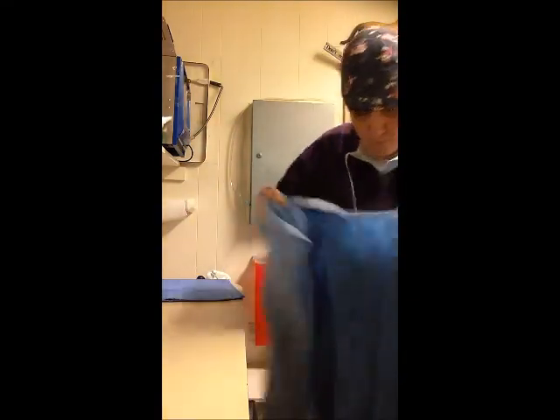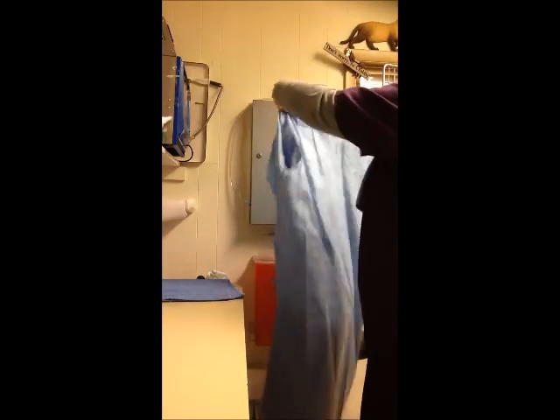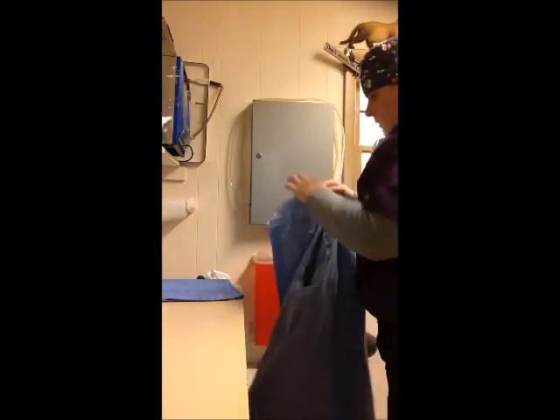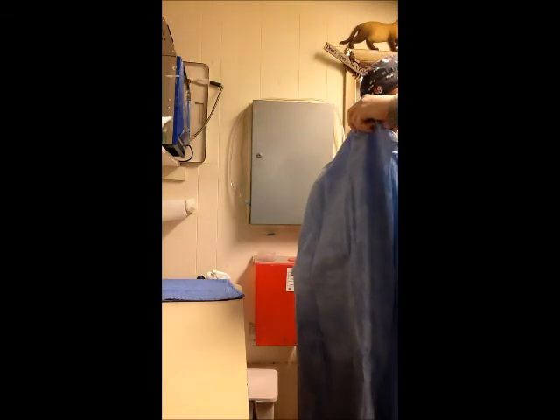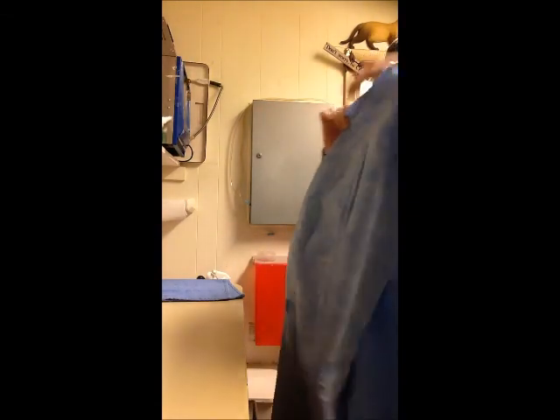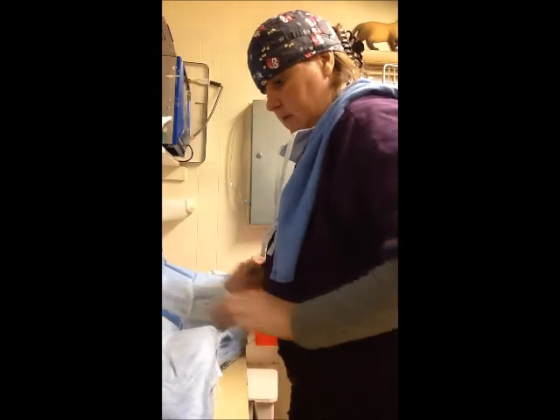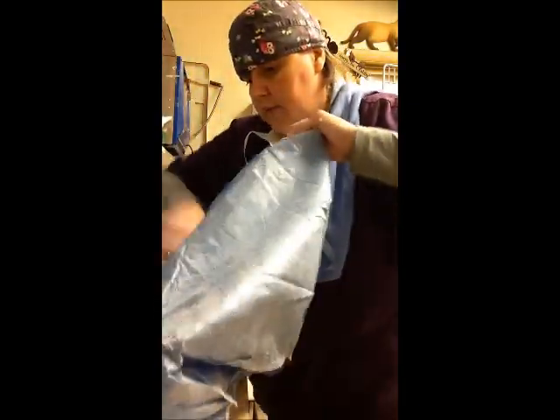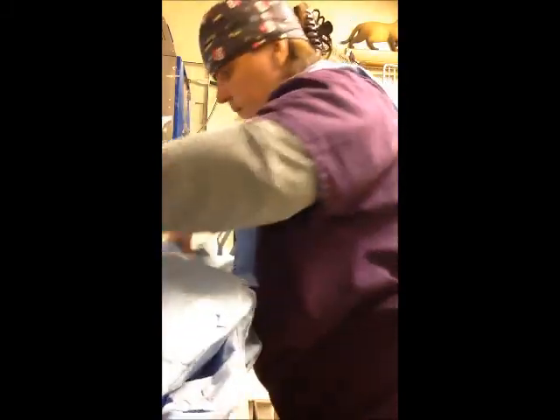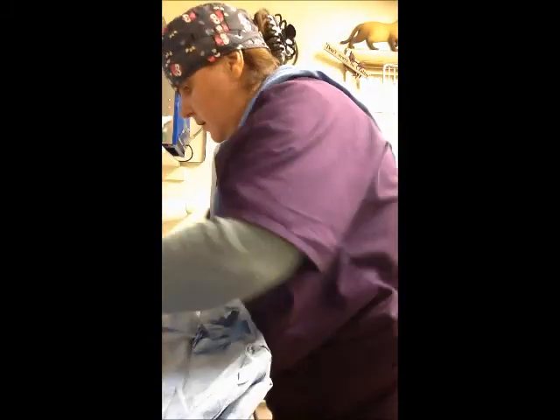Okay, so our gown is going to get wrapped inside out. So this would be outside in. This is inside out. And the hands and arms are in. We're going to take it, and it's going to be wrapped in accordion style. So we take it like this, and then we fold it on the table. Tuck the arms in and make them nice and flat.